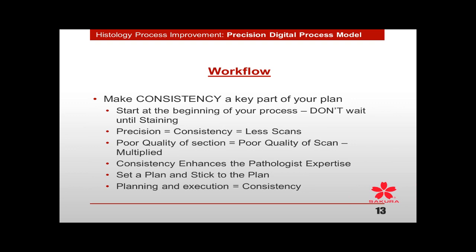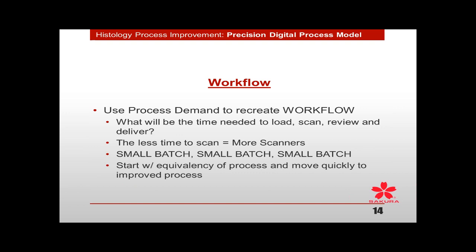So best quality is what you're trying to do, and you want to have the least amount of scans as possible. Your process will demand you recreate your workflow. And you have to sit down and really work through this one about what will be the time needed to load, scan, and review, and deliver.